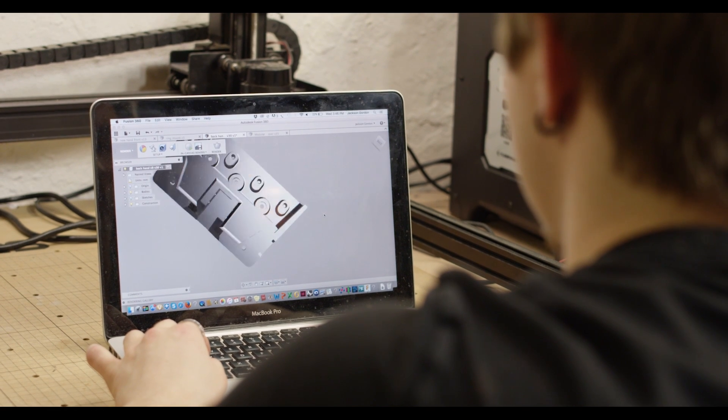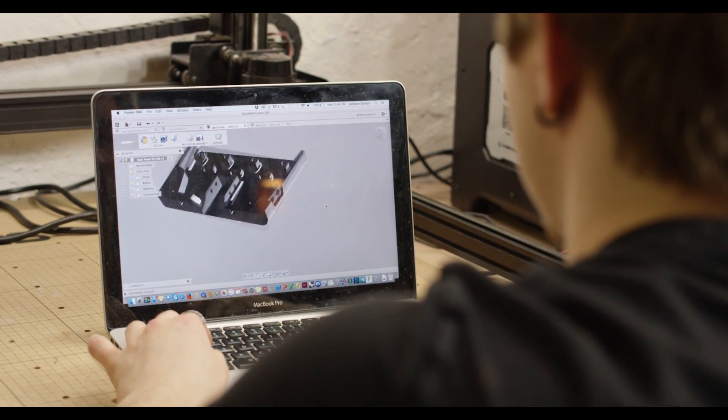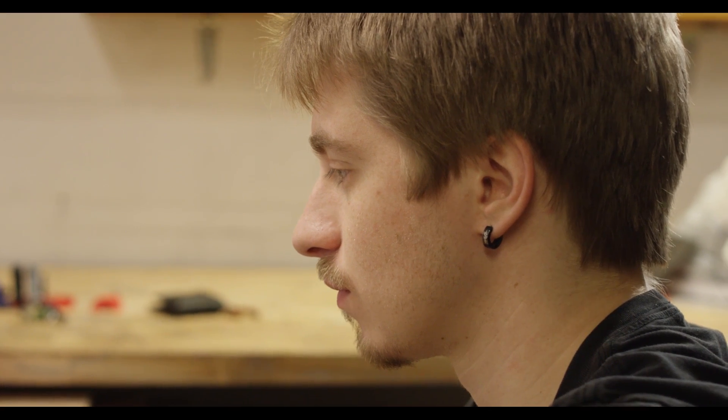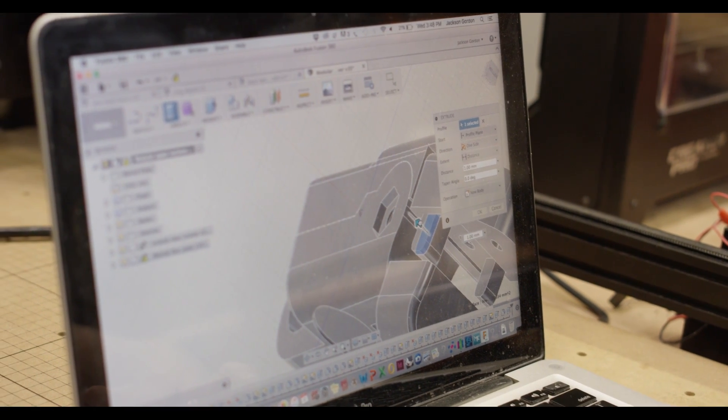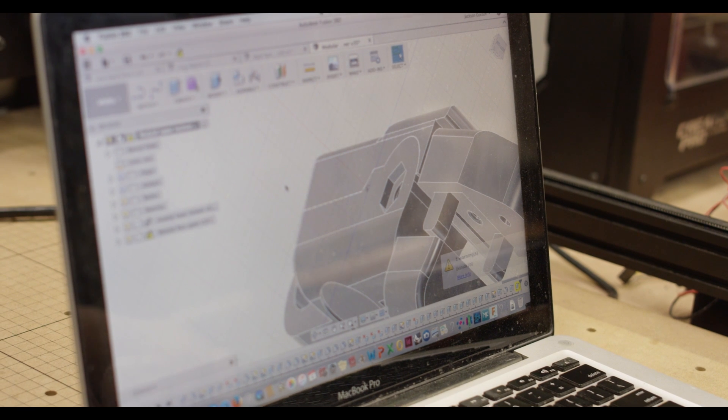This was all done in CAD — computer-aided drafting — so I could then print out the pieces three-dimensionally, test how they fit together, see how they worked, and figure out what I liked best before I actually started constructing the final hand.